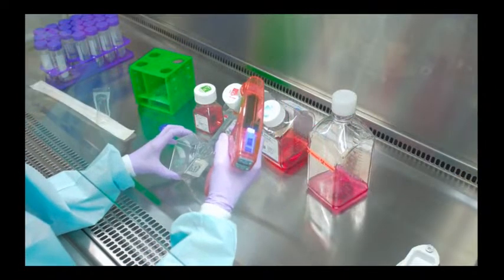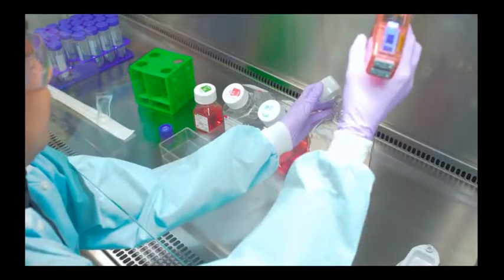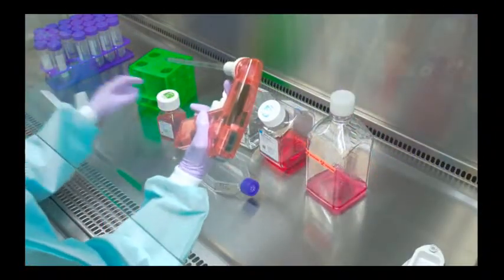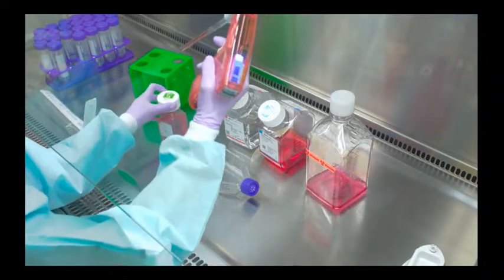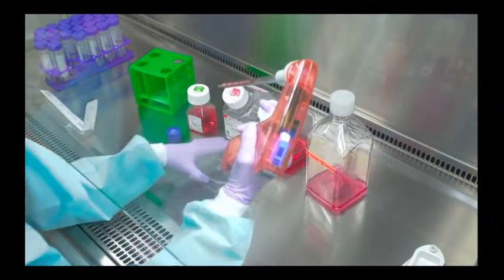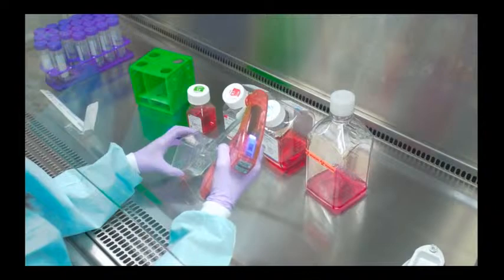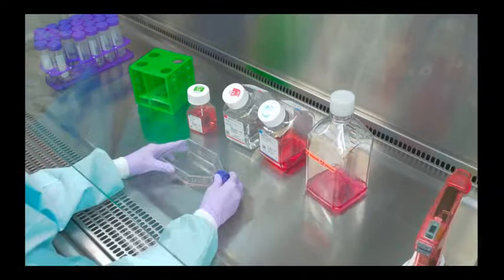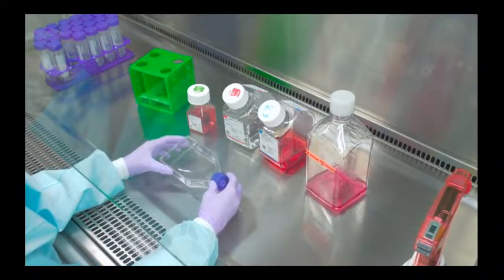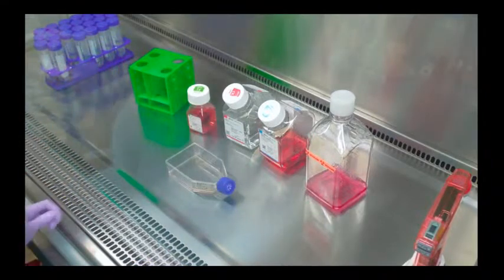After rinsing the cells, remove the salt solution. Each time you aspirate liquid off the cells, place the next solution on quickly. Add your cell dissociation reagent to remove cells from the plate. Use just enough solution to cover the cell sheet. Consider using a gentle dissociation reagent, such as TrypLE Express, to avoid damaging your cells during dissociation. Make sure that the solution completely covers the cells. You may want to tap gently on the plate to help the cells detach.